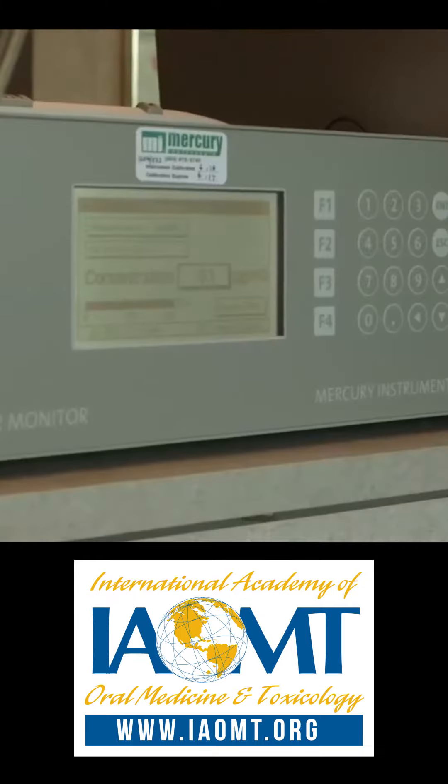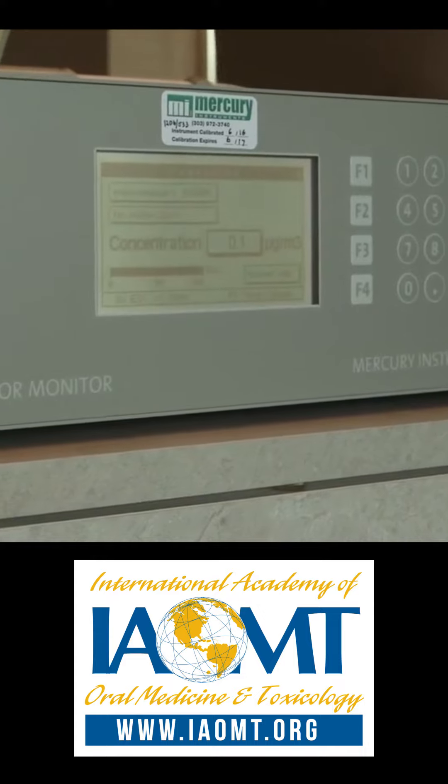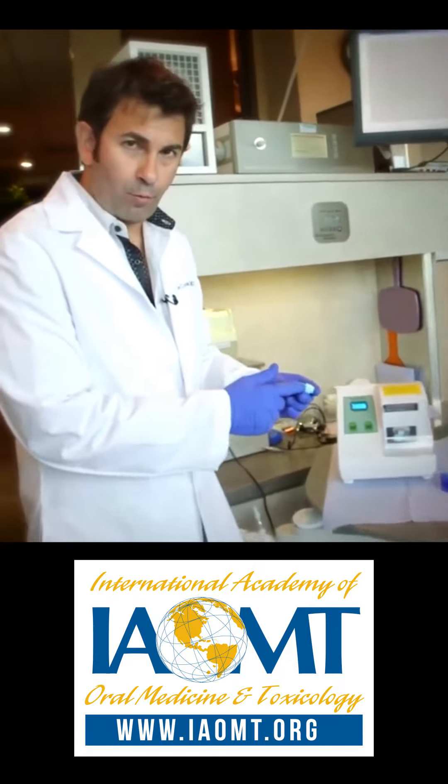Today we brought the Mercury Instruments VM3000 mercury vapor analyzer, which is designed to measure elemental mercury in the atmosphere. It's a very sensitive instrument and measures down to 0.1 micrograms per cubic meter. This is an amalgamator — the instrument that's going to mix the mercury with the other ingredients to form the amalgam filling.